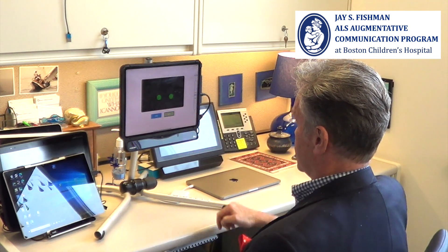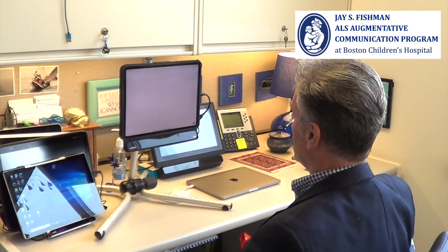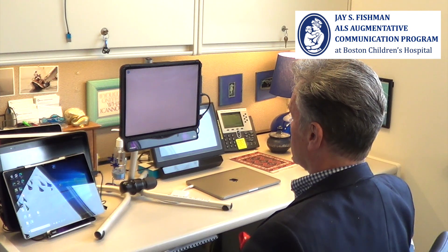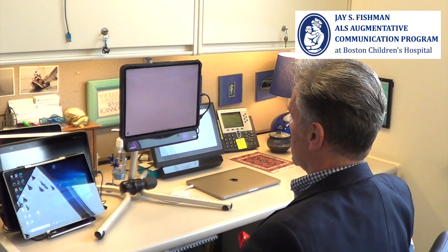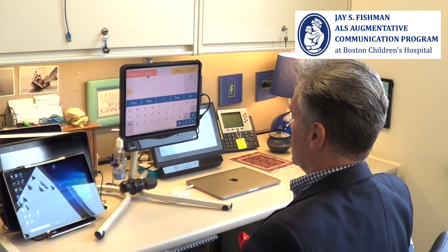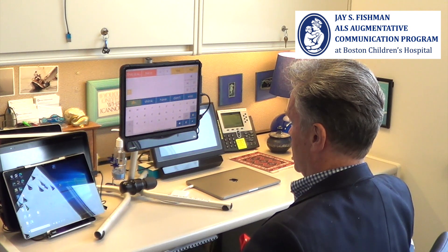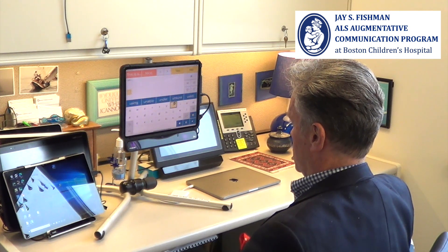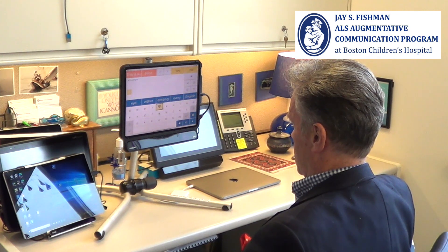I'm right in the middle and I'll tell it to start. Alright, I am using eye tracking.